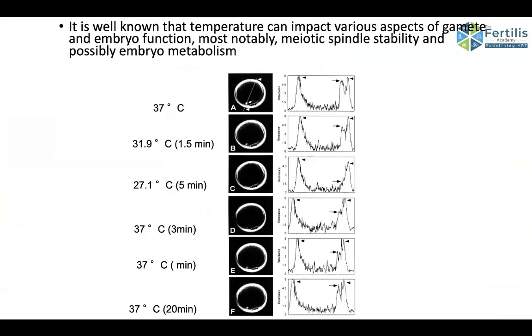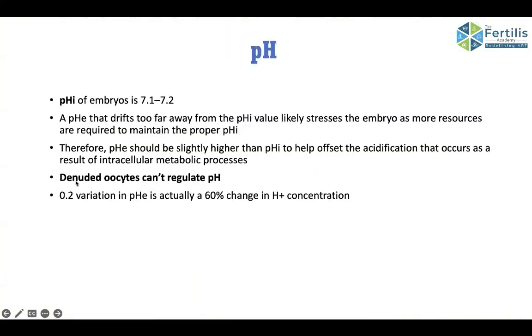These are the gadgets to take the temperature, and this is a landmark study in which they showed that minute changes in temperature will affect the mitotic spindle or the meiotic spindle. It will go on vanishing. So try to maintain the temperature.